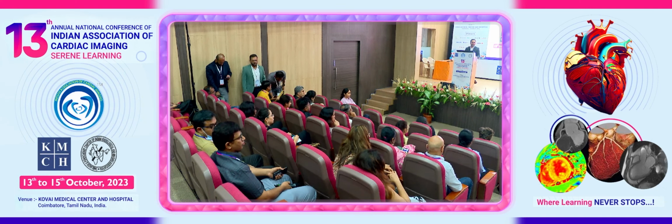We had a situation where one valve gets put, and the other 2 company representatives had left. They were halfway down to Delhi, and imagine this valve popped out or some issues happened. Then we had to call them back, saying we need the other kind of valve. So a lot of chaos happens. So for sure, you need to pre-decide this and have it really astutely done.